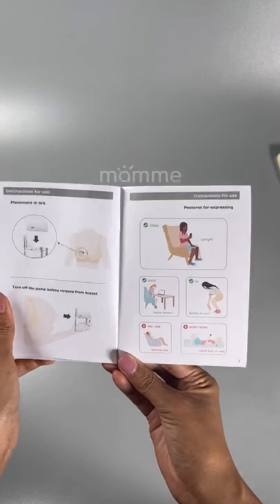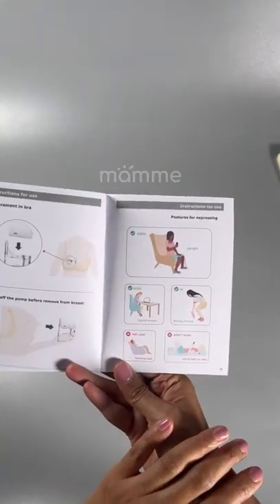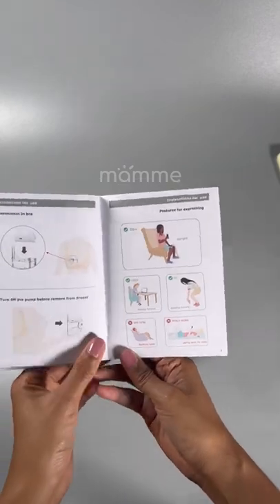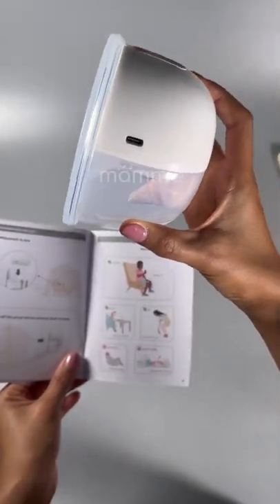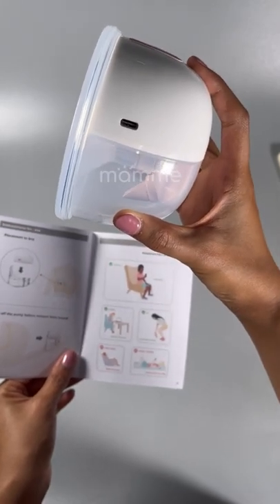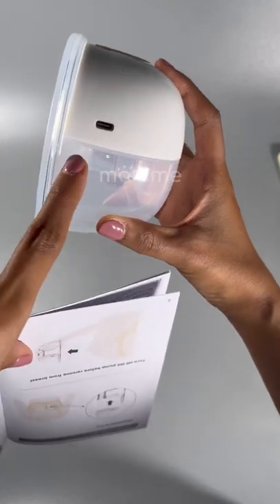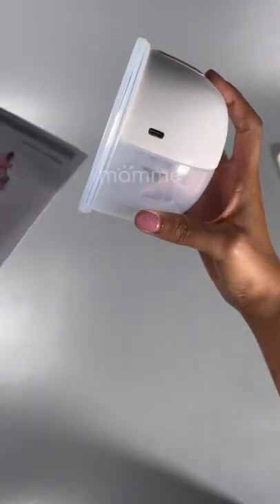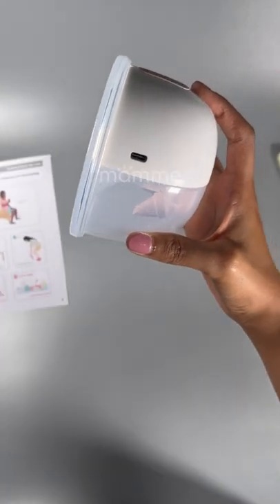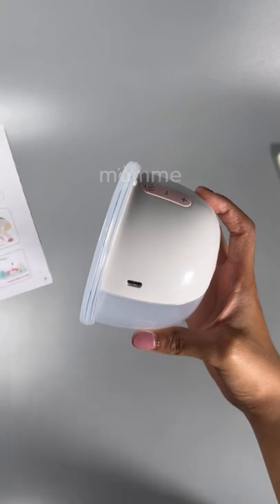So, how do you wear a wearable pump? Diba? So, there are do's and don'ts. Ang ideal is upright. Okay, so what is upright? Dapat ang pump mo ganyan. Medyo slightly leaning forward. Ayan. Ganyan. So, andito ka, tapos dapat yung flow of milk pababa. Ayan. So, make sure na ganun yung position ng pump mo when you start using this.